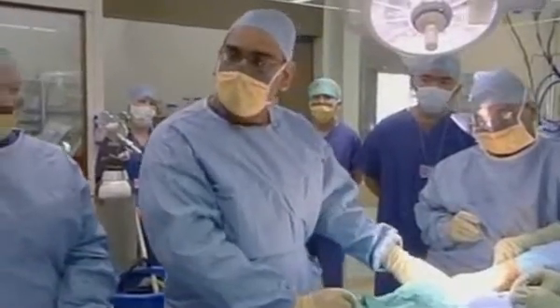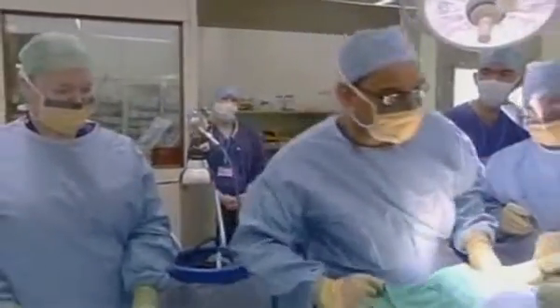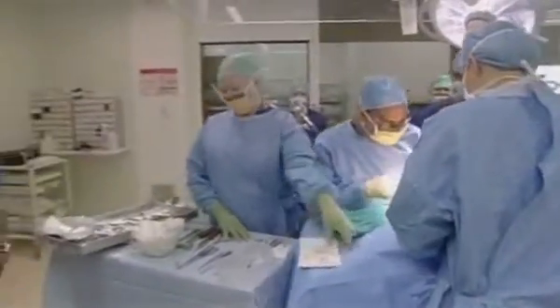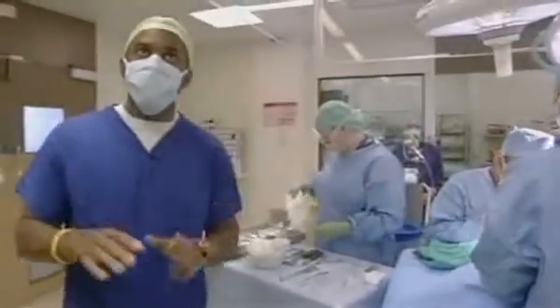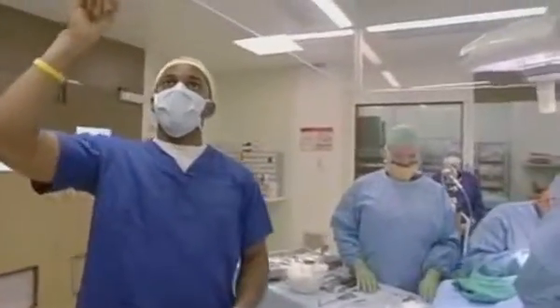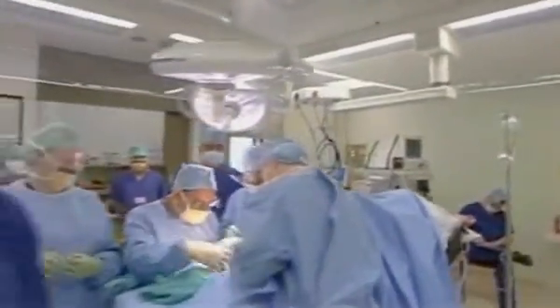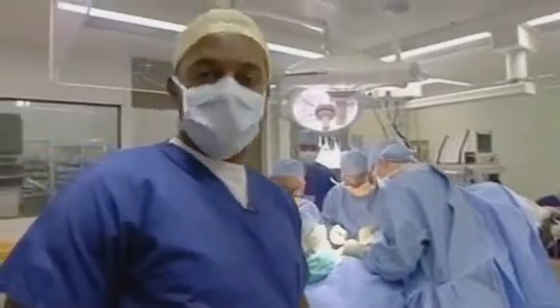Are you happy for us to stay here? Yeah. Excellent. Please do. Obviously you'll be carrying on. So the sterile pen, by the way, that pen is sterile. Everything in here is sterile. In fact, Grant, go back a bit. You can see we're working underneath this big shield, which keeps the air pressure the same all the way around. If you can stop marching now. Thank you.